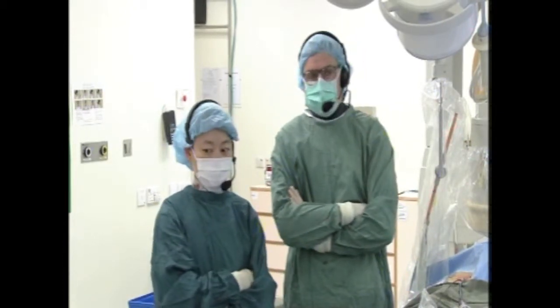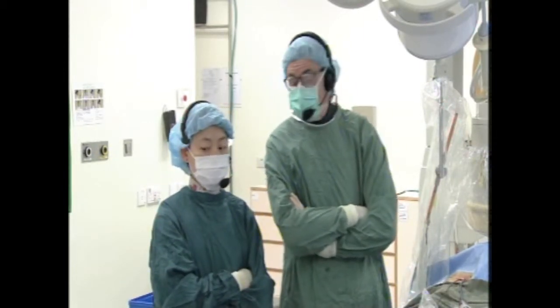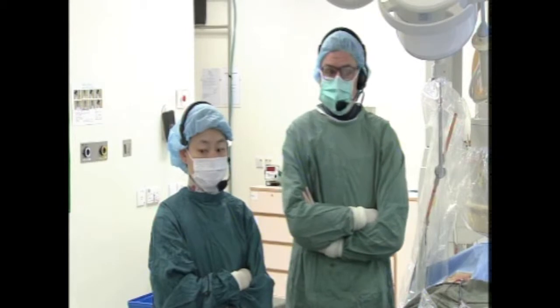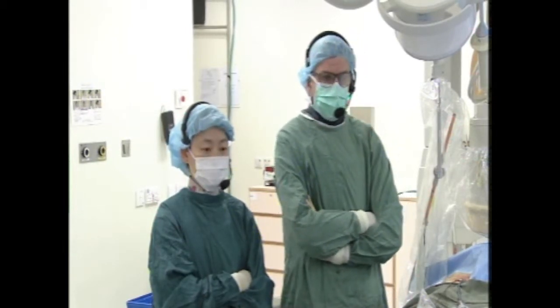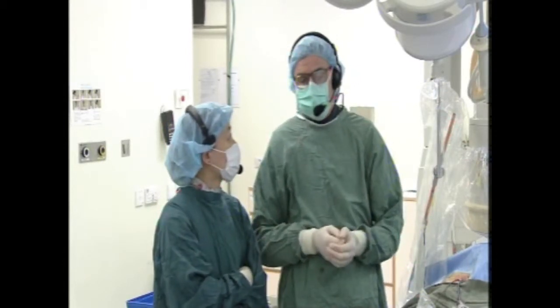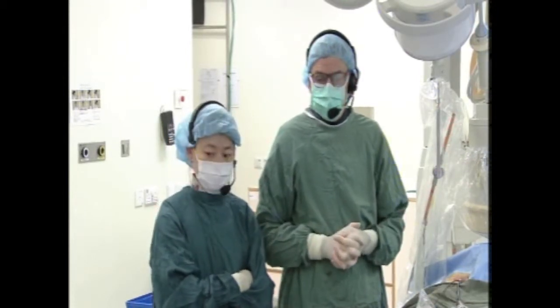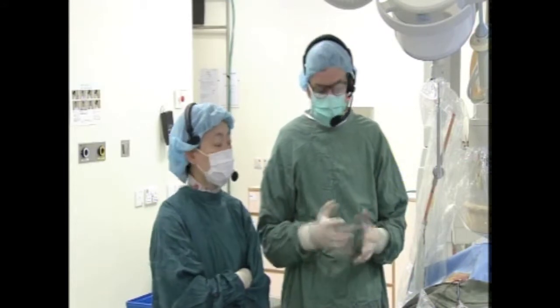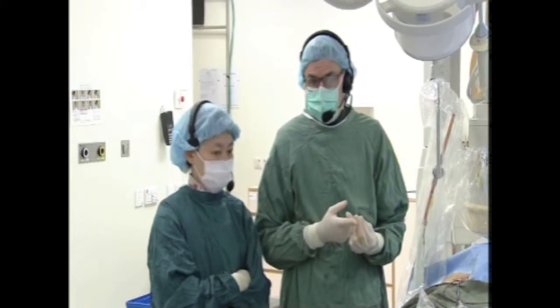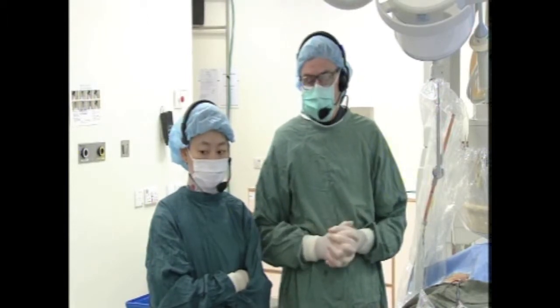Yes. Also, what we have seen here down in the cath lab is that she got some intermittent SVT. I cannot rule out that it's us causing it with the guide wire and catheters. On echo she also had a quite volume-overloaded RV. At the beginning of the procedure we measured the pressure in the pulmonary artery. Mean pressure was 18, so there's no sign of pulmonary hypertension. So I think that's a good indication. She's symptomatic, she may have SVT, and she has a volume-overloaded RV, a moderate-sized ASD, and no sign of pulmonary hypertension.